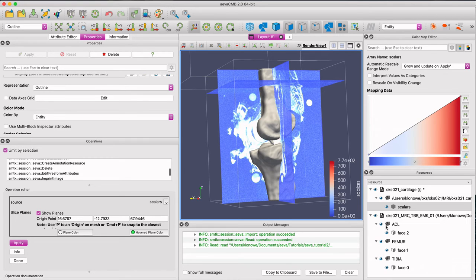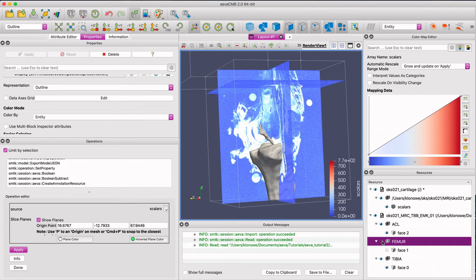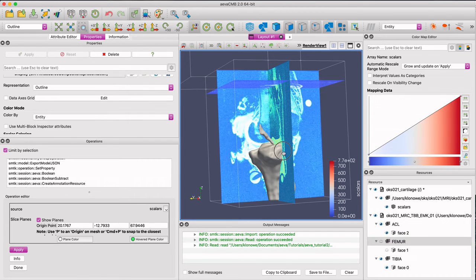You can use the resource panel to turn visibility on or off and move between MRI slices to better view your geometry relative to its volume.